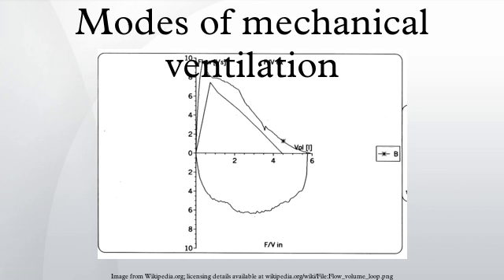There have been substantial changes in the nomenclature of mechanical ventilation over the years, but more recently it has become standardized by many respirology-pulmonology groups. Writing a mode is most proper in all capital letters with a dash between the cycle and the strategy.